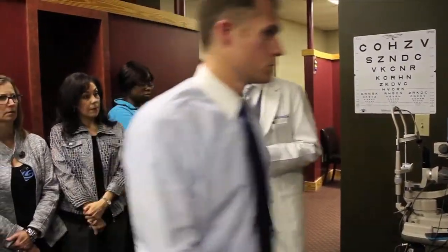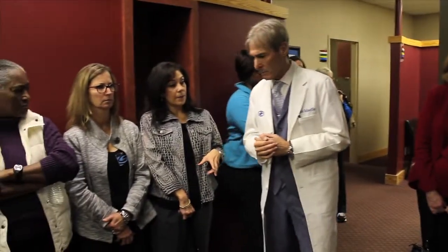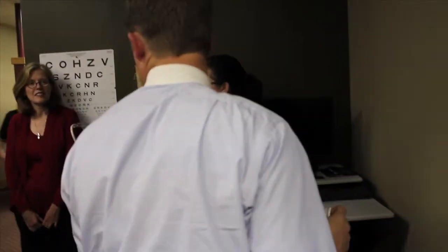So will the procedure be administered by a technician or actually a doctor? The doctor always places the lens in the eye and removes the lens out of the eye. The technician will stand here. We always have an assistant and someone's always in the room with you. And right now there are just two or three because everybody's watching it get done.